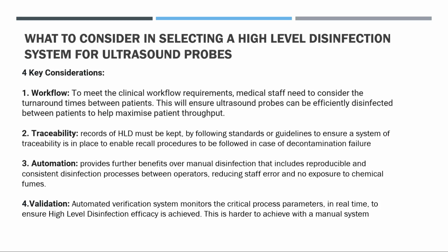Traceability. You certainly want to keep records of high-level disinfection, making sure that the disinfection occurred properly and the system worked. Automation certainly provides benefits over manual disinfection, as opposed to, say, dipping a probe into a liquid chemical, that include reproducibility and a consistent disinfection process between operators. It reduces staff error, and very important, if you're using UVC, does not provide any exposure to chemical fumes, and therefore maintains and assures safety of the healthcare personnel.